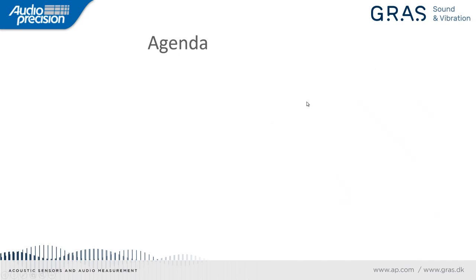All right, so we have a lot of material to cover today. I'll just launch right into it. The agenda we're going to follow here is first, a very brief introduction of an overview of hearing aids. So I just want to be the first to say that I have a lot of expertise in audio analyzers, but very little expertise in hearing aids. So I'm by no means an expert, and if that's what you're expecting, I'm sorry, but you may be disappointed.